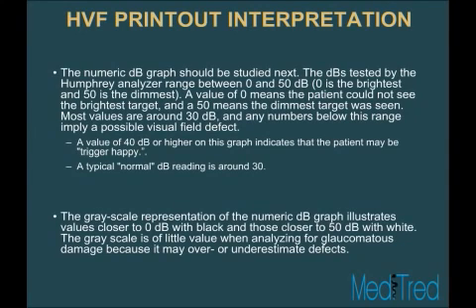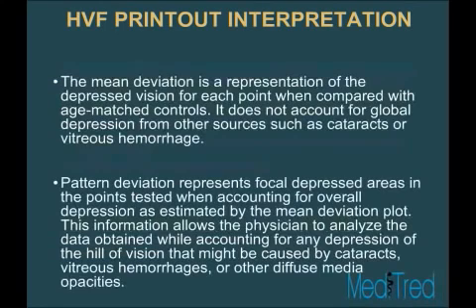The grayscale representation for the numeric decibel graph illustrates values closer to the 0 decibel with black and those closer to 50 decibels with white. The grayscale is of little value, I think, when interpreting and comparing across different visual fields, but is used for patient education. It's something that patients can visualize and really understand when you're showing them the grayscale versus showing them the specific numbers or the mean deviation and pattern deviation.